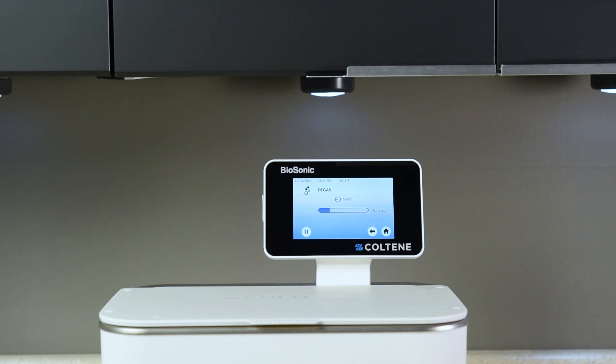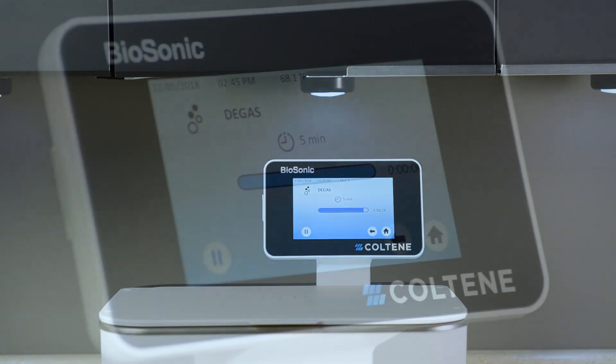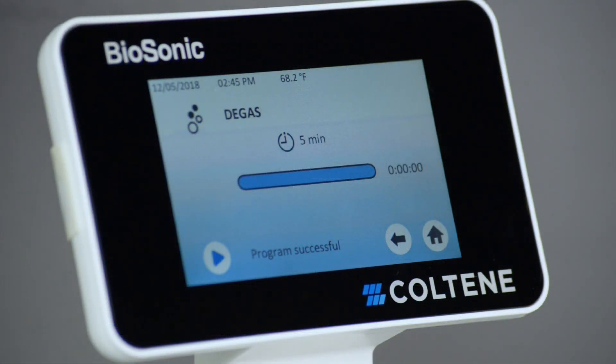The unit will begin to cycle on and off during the five-minute degassing process. Once the timer reaches zero, the words 'program successful' will be displayed.